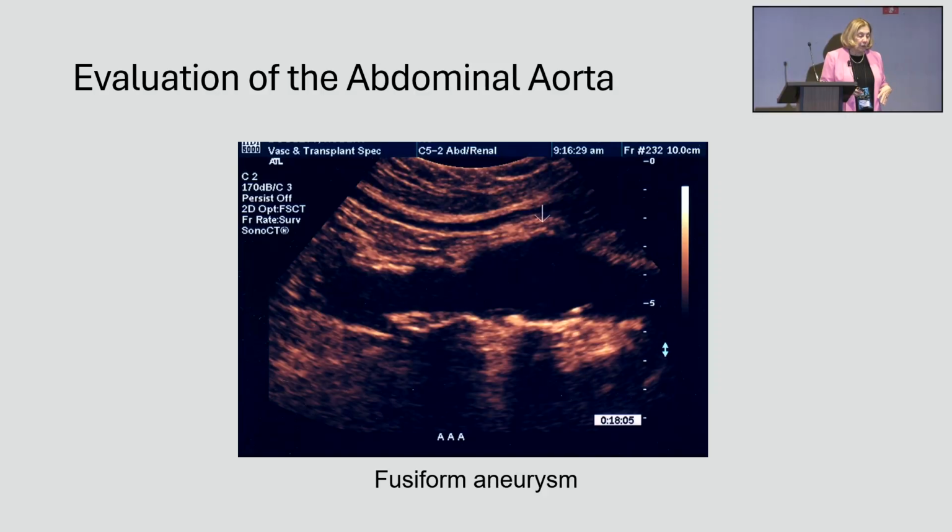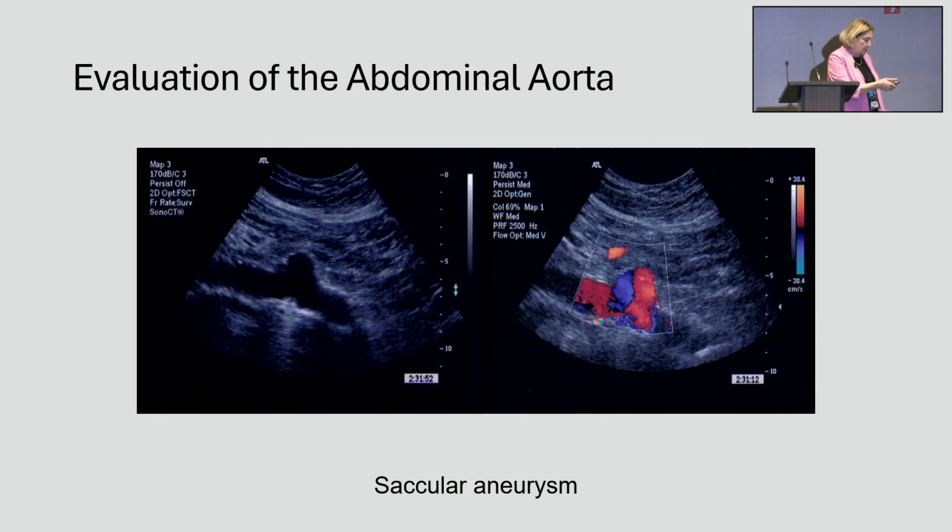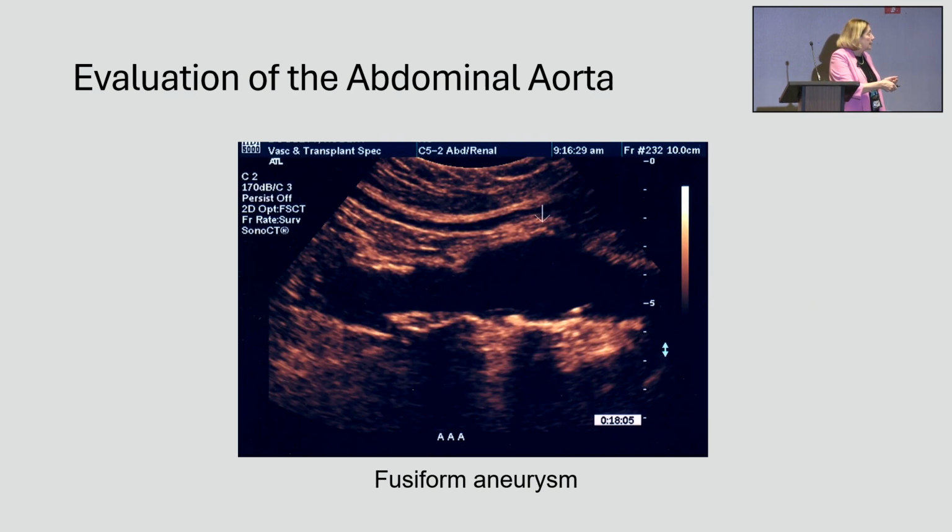So this is a rather older image, and from vascular and transplant specialist days. It shows you a nice, again, color B mode, which sort of lights up some of this. We do see shadowing, so we can say that, I'm sorry, I'm pressing the wrong button. We can see some shadowing, which is the thing you need to see to say that's calcified. Just because something is brighter echogenic material doesn't mean you can say calcium. It's bright, but if it shadows, we can say calcific.